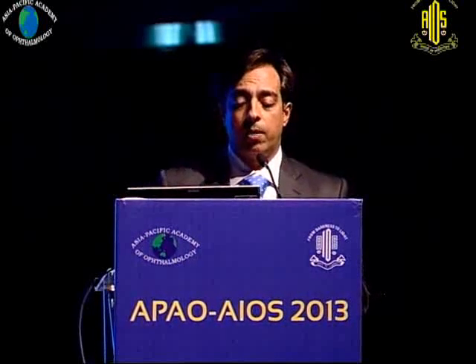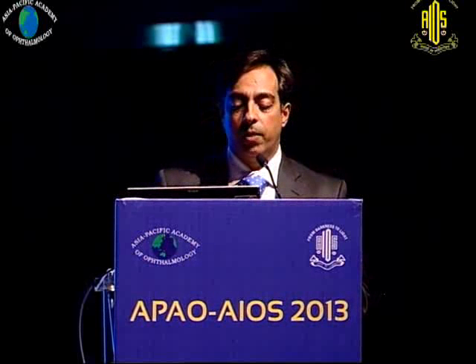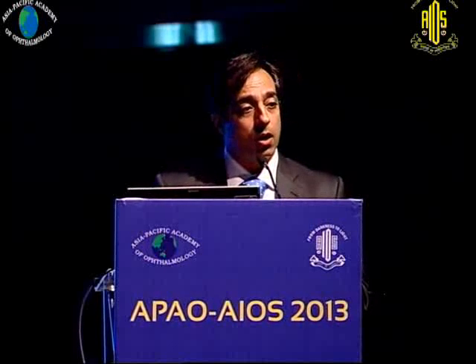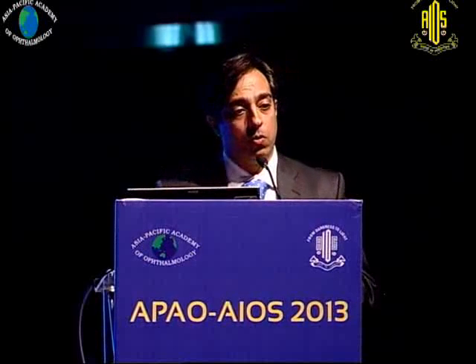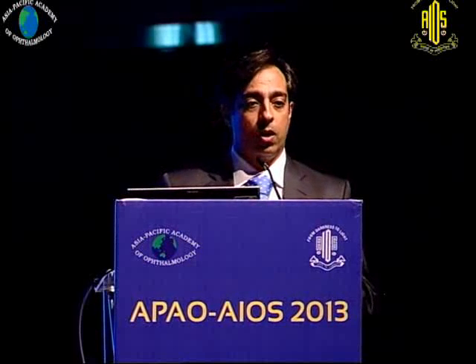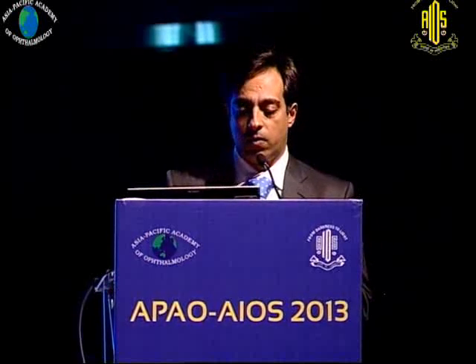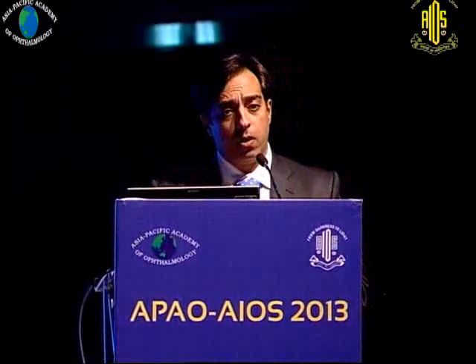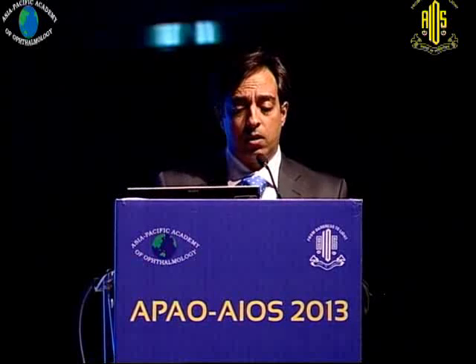So sometimes you might have these rare cases where the very mid-peripherally you might have tears or rips happening because of lesions which are pre-existing. So one has to make sure that you clear the vitreous, laser that whole area properly, and then of course take care of the hole and the gas, whatever one wants to do in such cases. So PVD creation also needs to be checked after you finish it, so that you don't create breaks.